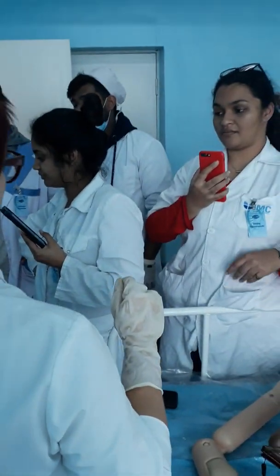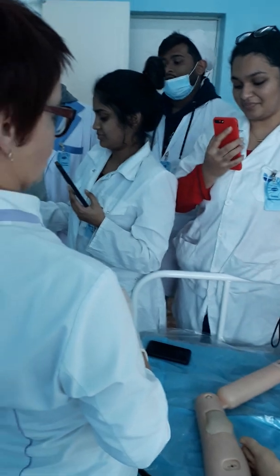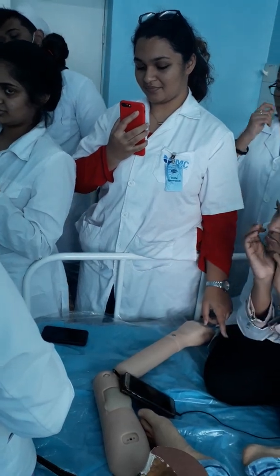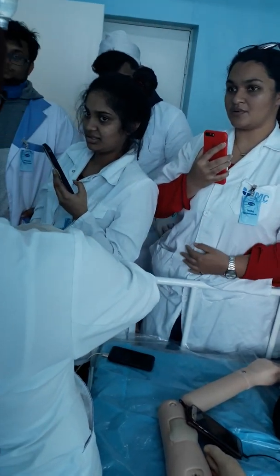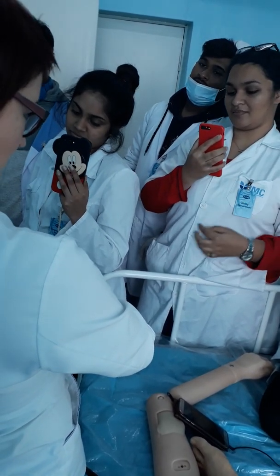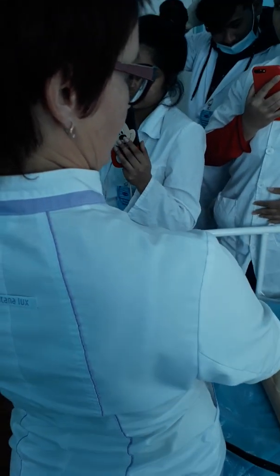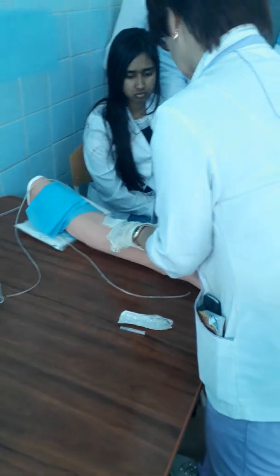Why do you have to close AV when you get a new solution during your infusion? Why do you close AV? Because if you do it without closing, the solution will flow backwards, in reverse. If you close it, you don't get solution in reverse. Understand?